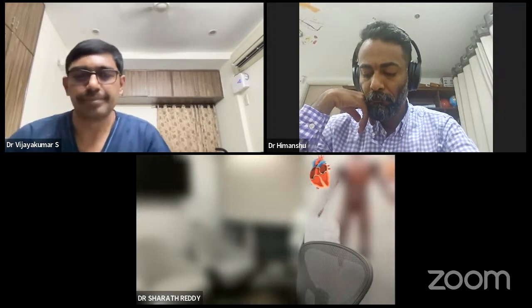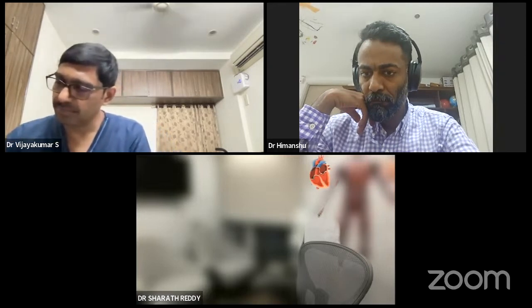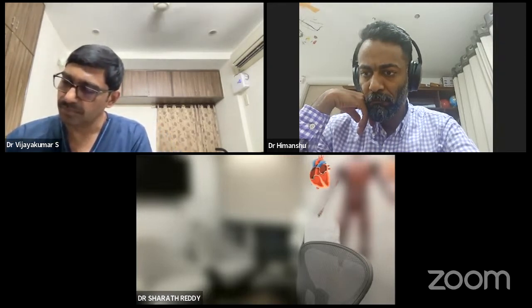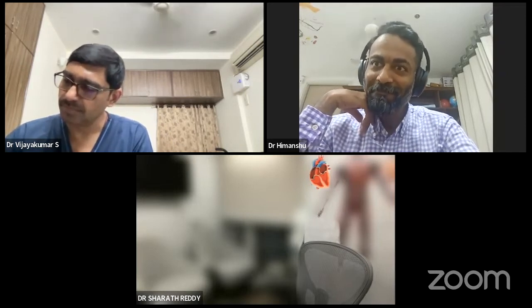And as Himanshu mentioned, Himanshu suggested we shouldn't open the LAD when the lemma is patent, but that's exactly what I did. Sorry, Himanshu. So I'm confessing before and moving on to the live in box.